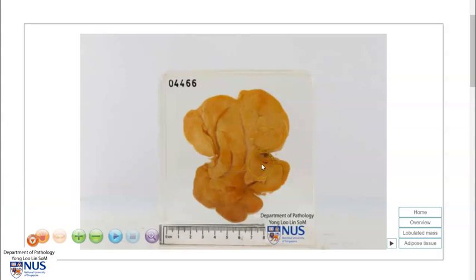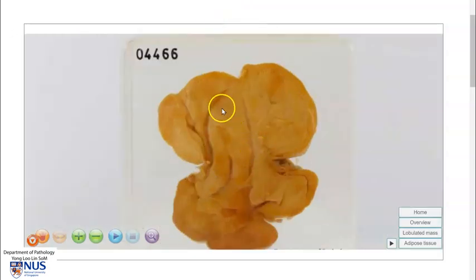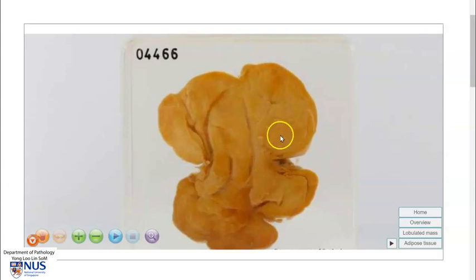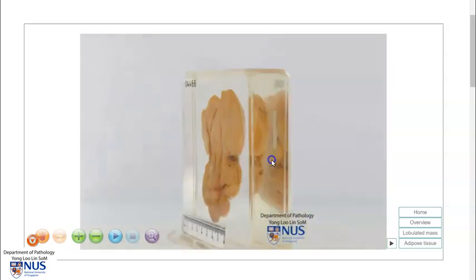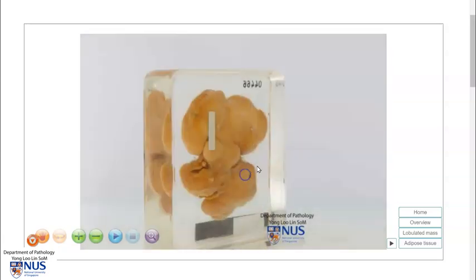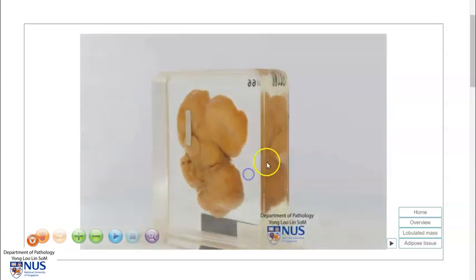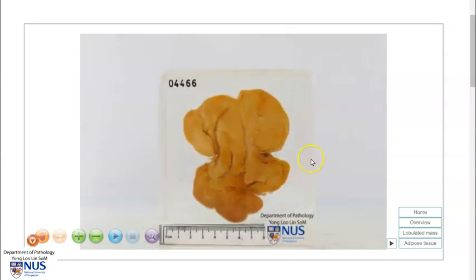Hello, this is a virtual pathology specimen of a lipoma, which is a benign adipocytic tumour. You can see that this tumour is very rounded and lobulated, and we are looking here at the cut surface, which shows a relatively yellow, homogenous appearance. As we rotate this tumour, you can see that it has a very rounded, well-circumscribed outer surface, and this tumour is usually easily enucleated during surgery.